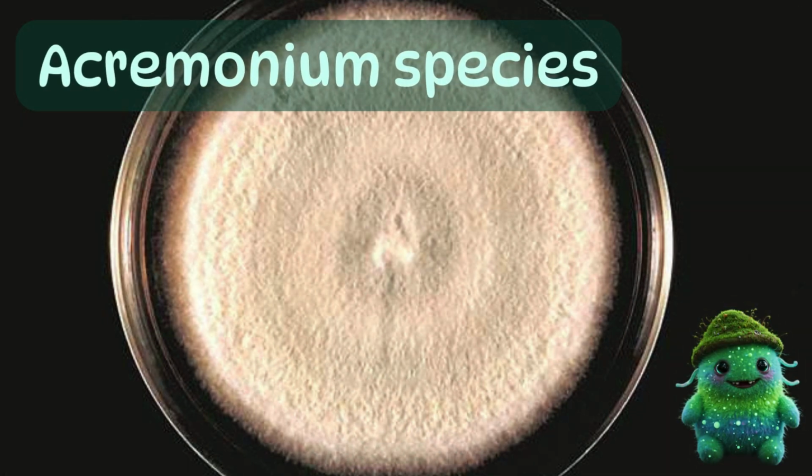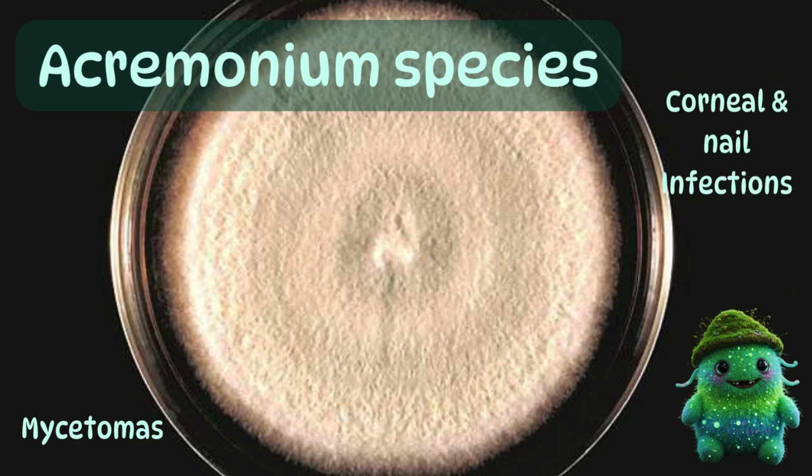Acremonium is in at number 6. Although it may be a contaminant, Acremonium has been reported as an agent of mycetomas, corneal infections, and nail infections, as well as a rare cause of invasive disease. The colony is usually light in color, white or pale pink, similar to Fusarium but very compact.